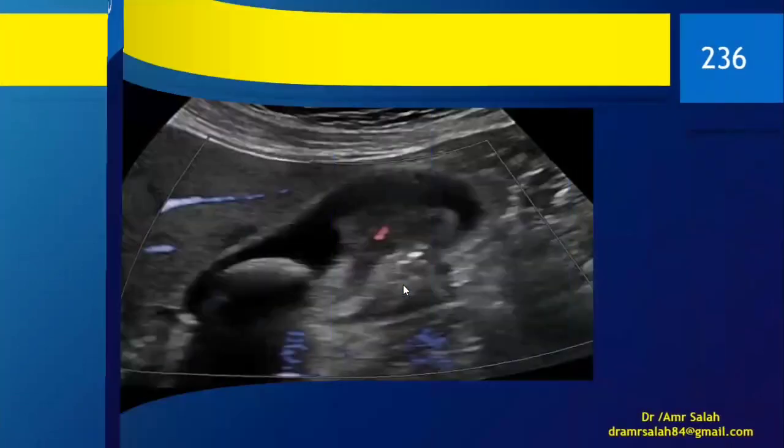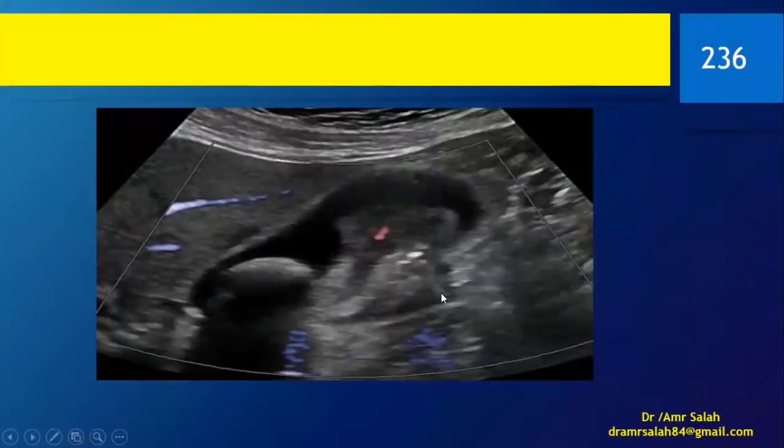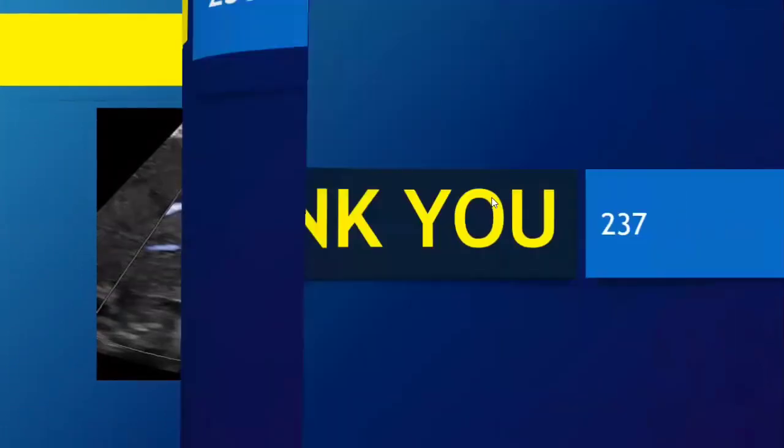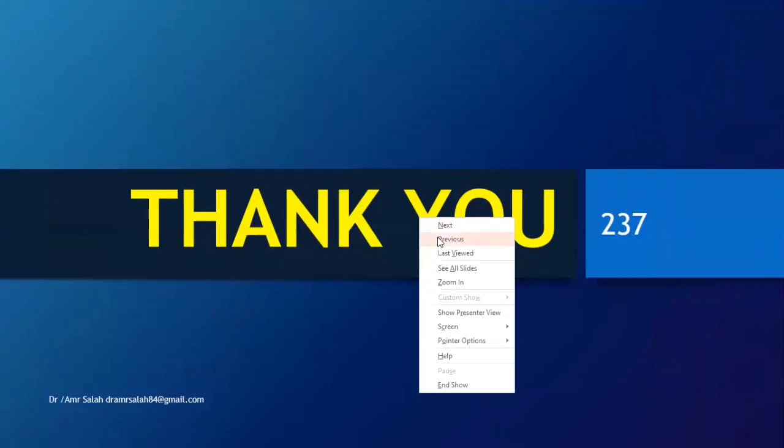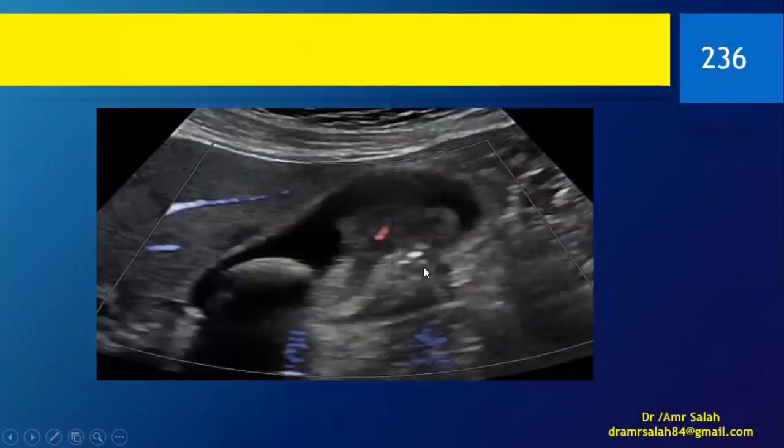Okay, what about this? Will I make the patient worried or not? We have here a polyp, okay, that has vascularity and that is associated with a stone that is single and more than 1 centimeter, and a polyp associated with a stone carries more risk for malignancy. So we have here a polyp that is really concerning and it might be cancerous, okay, and this is the gallbladder carcinoma. Yeah, bravo.